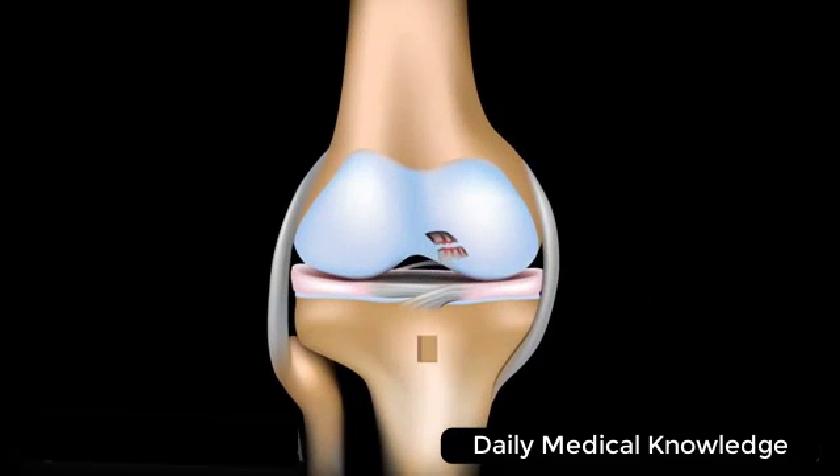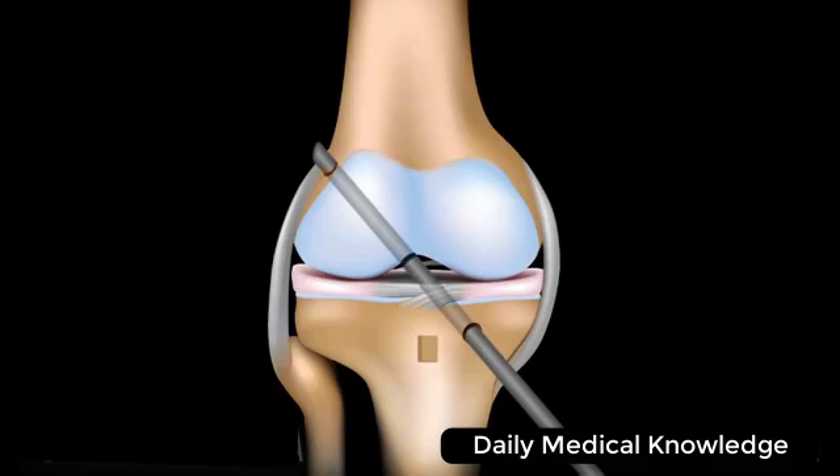The damaged ACL is removed. A channel is drilled diagonally through the tibia and the femur. The graft is pulled through the channel, and special screws are used to secure the graft in place.